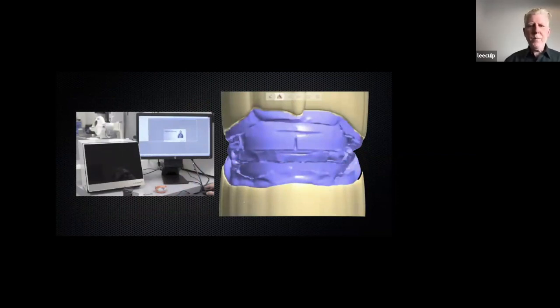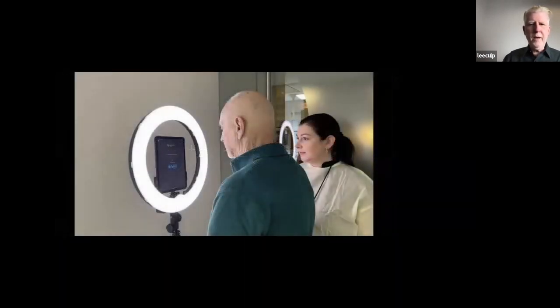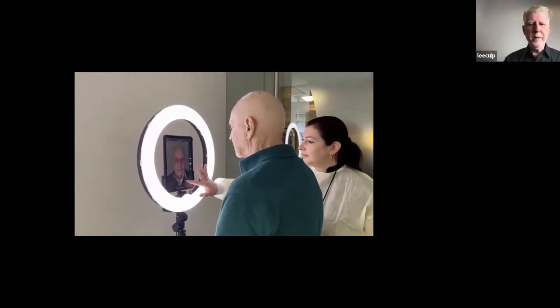So you can do this, or if you see the little package down there at the bottom, the physical package, if this was a denture, this is what John just scans in his office with his intraoral scanner. So it's basically kind of the same information. So they all kind of interrelate, and we can show you what we're doing here, but it gives us our starting point to set our teeth. So we've got our midline, we've got our incisal edge, and then we're going to add one more little set of information here. If you have never seen a Vellus, it's going to make you want one really bad.